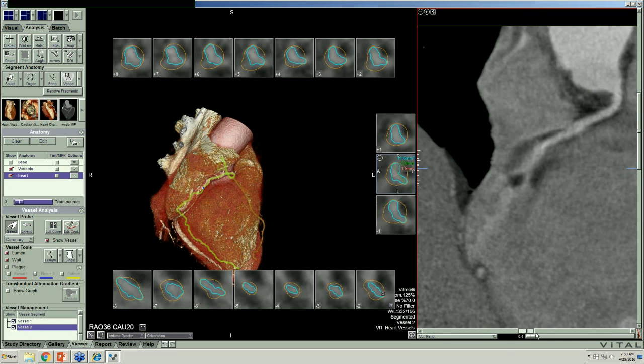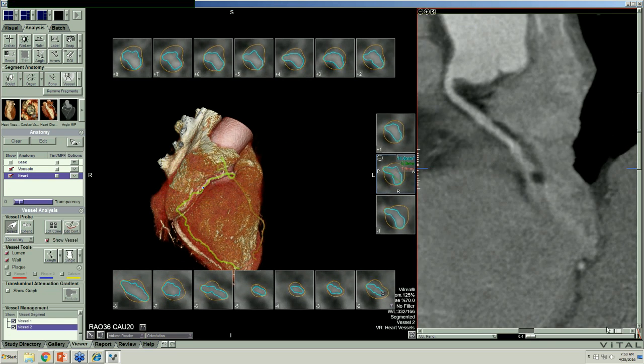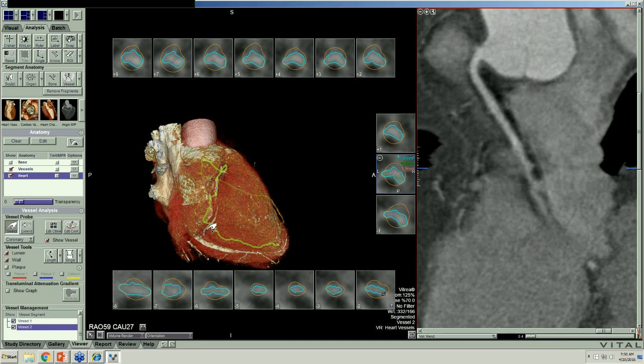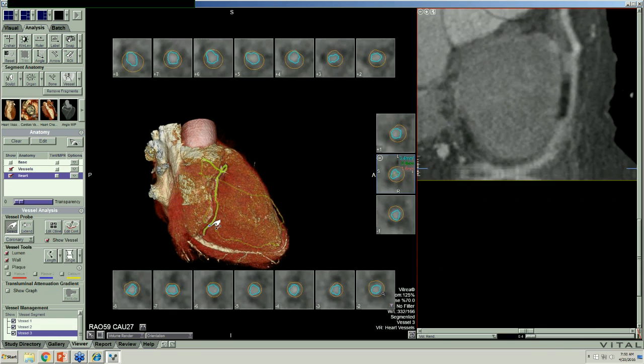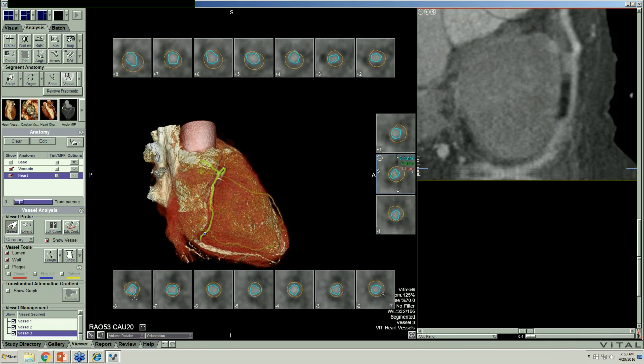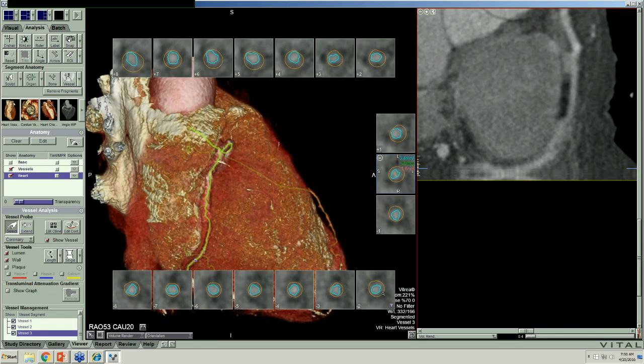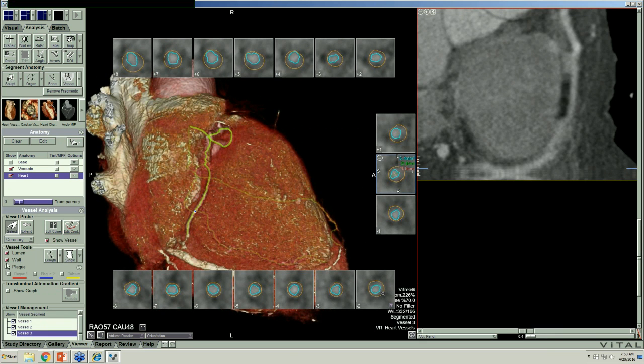And the right, certainly proximally the right's not bad. Check it out more distally, but certainly proximally it's not bad. Let's go down here and take a look at it. And you can't see it very well. There may be some motion artifact, so we can't see that very well.